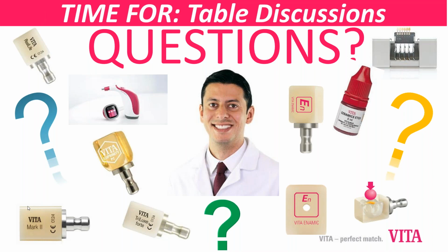The great thing about Ambria, as I was saying, is that lithium disilicate is a strong material. If you bond it, as I showed for anteriors, which is much easier, you will reinforce it, but the material is sufficiently strong to go with conventional cementation for those situations.